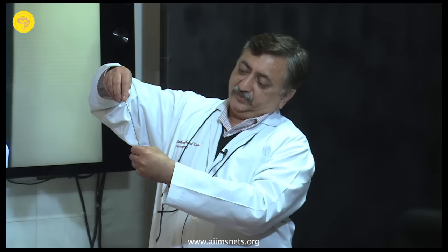There are many ways, two or three ways described, but this I found the easiest because you can never miss the facet and you can never miss the S1 foramen. And if you have these two lines, you will always be inside the pedicle. So that's regarding S1. The widest possible, the largest possible screw you can use, you should use in the sacrum. Because your construct, 99 times out of 100, ends at S1.